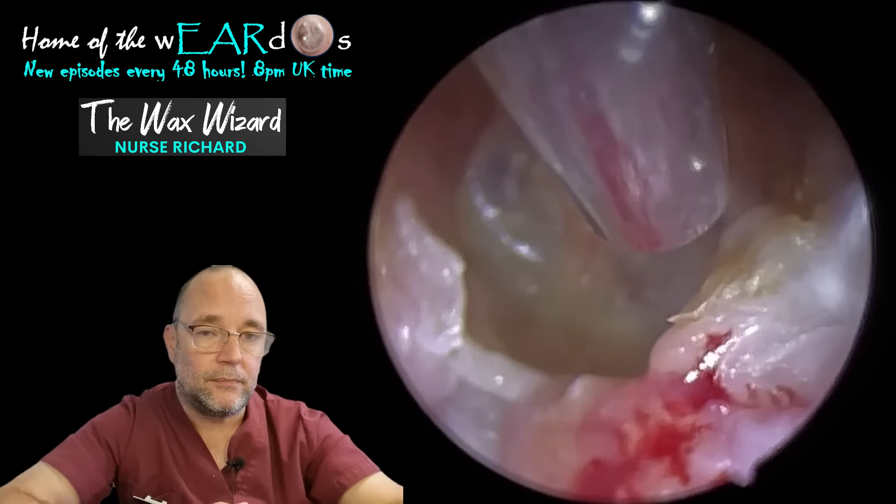Top-down is when there's something like a big skin plug, like you've just seen in there. We've pulled that out. And what that can do - the big skin - it can start burying down into the floor of the ear canal, causing craters like this. And that would be an ear canal cholesteatoma, which is quite rare. Do I think that's what this is? I think that's probably the most likely, because I did ask her about her medical history - if she had diabetes or any condition that she knows of that restricts her blood flow - and she wasn't aware of any. I've still asked the doctor to look into that to make sure she hasn't got any of those things, because this might be the first sign that blood flow is compromised. So we can't rule that out.